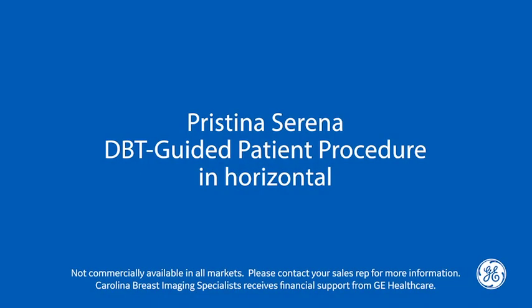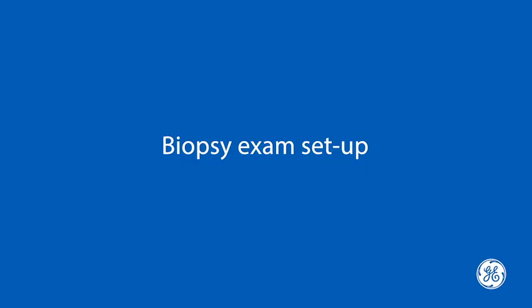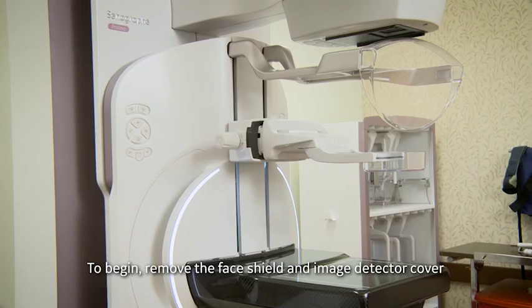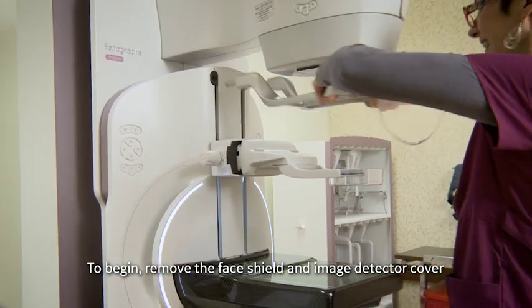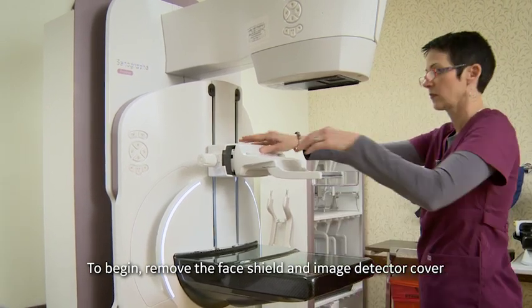Pristina Serena DBT Guided Biopsy — Biopsy Exam Setup. The Senographe Pristina has capabilities of being used for biopsy, both in 2D as well as in 3D.